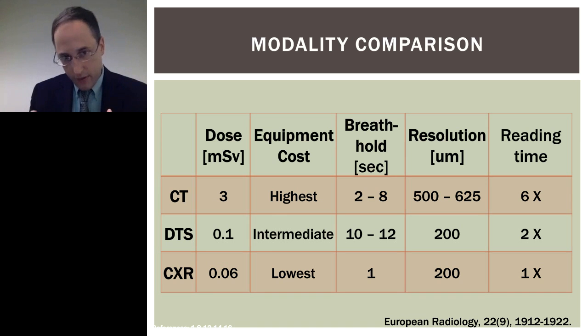I have references down here, there have been many dose calculations for what tomosynthesis is, and they all come in that range, just like there's a little bit of variation from institution to institution. Chest X-ray is about half a tomosynthesis. Okay, so a tomosynthesis is very, very close to a chest X-ray. It's about 2 chest X-rays, PA and lateral, but it is a fraction of what you get in CT.